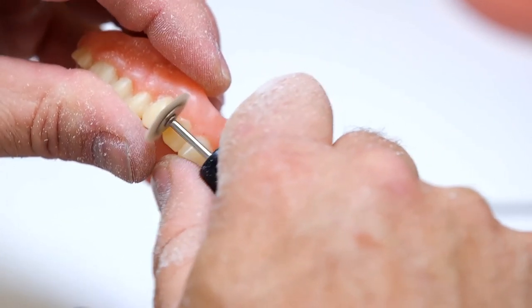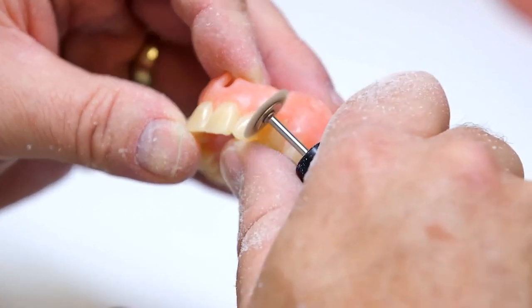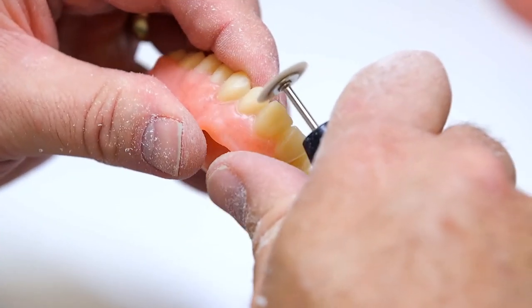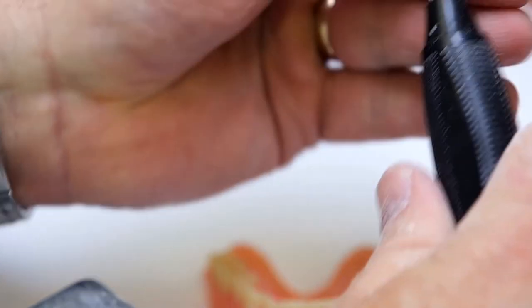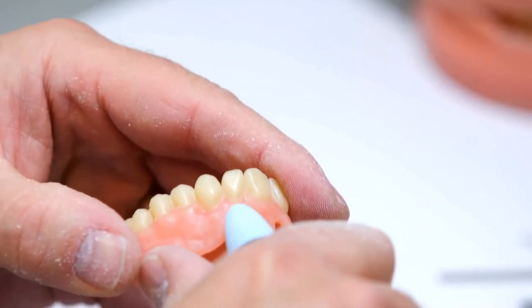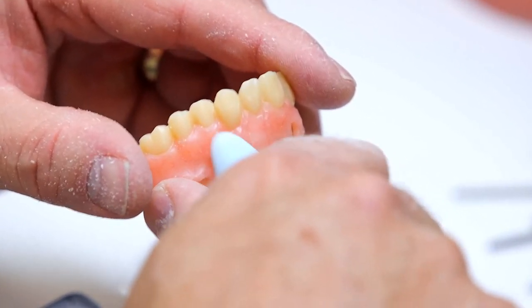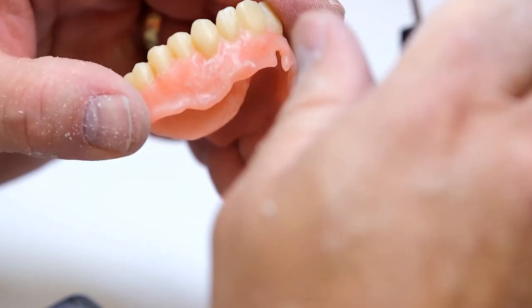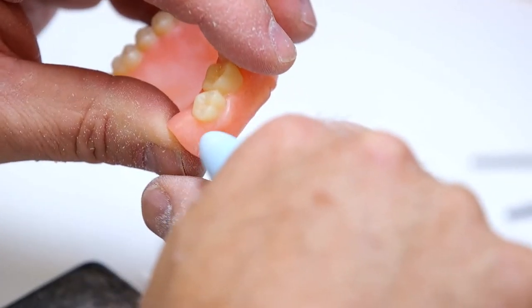And while you're in there, you can also do a little polish in the interproximals. Now, I won't video polishing the entire denture, so I'll just pick a side and stick on it here to show you how quick and easy this is. I'll take a medium silicone wheel, and I'll touch up those areas that the holder bars were on, or that I may have gone in and polished. So this is the closest thing I get to pumice or a rag wheel on a digital denture. Just clean up those areas nicely without burning it. So light pressure, let the tool do the work.